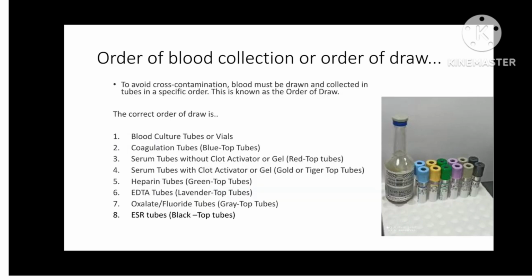Next, we are going to learn about order of blood collection or order of draw. To avoid cross-contamination, blood must be drawn and collected in tubes in a specific order. This is known as the order of draw.